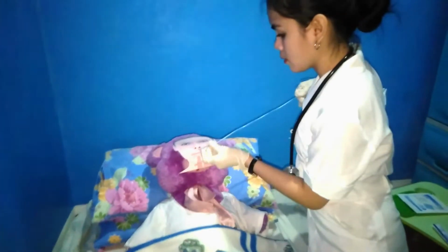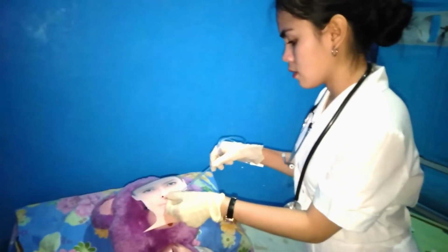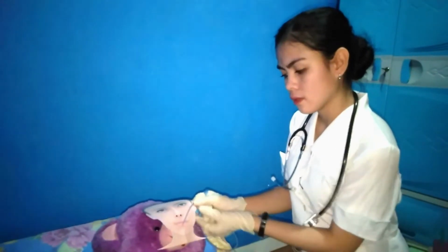We can determine how long the tube is to be inserted by measuring the distance from the tip of the client's nose to the tip of the earlobe, and then from the tip of the earlobe to the tip of the xiphoid process.